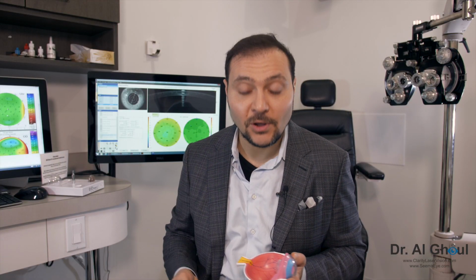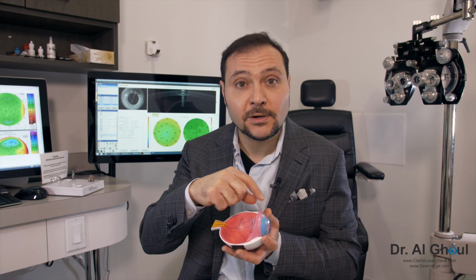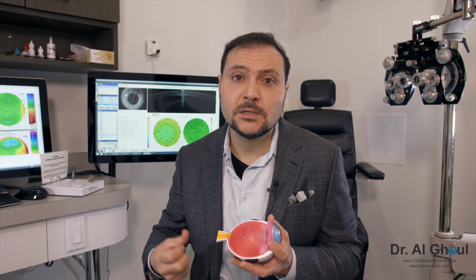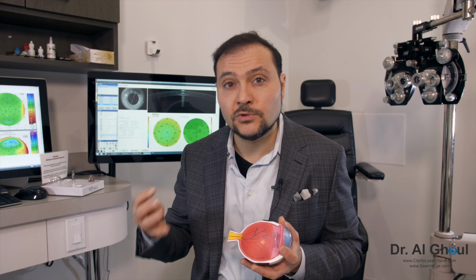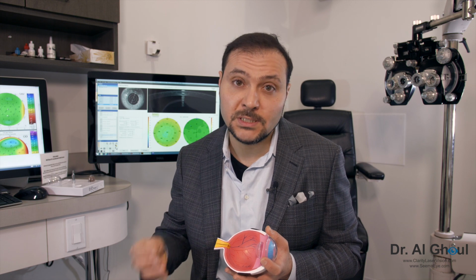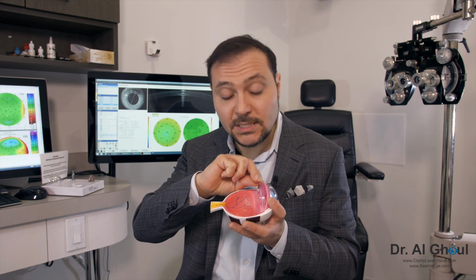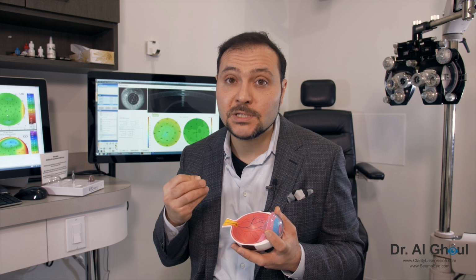If you look at this cross section of the eyeball, you've got the cornea, the front part of the eye, you've got the lens, which focuses the remaining part of your vision, and you've got the back of the eye. So if, for example, you're -10, doing laser treatment on the cornea for a -10 would be considered a high refractive error, and that's where it's a little riskier. You're potentially inducing risks of dry eyes, ectasia, and unpredictability of how good you'll see. The beautiful thing about ICL is that this foldable contact lens is inserted in front of the natural lens behind the pupil, and usually, honestly, by the next day or two, you're seeing immediate results.